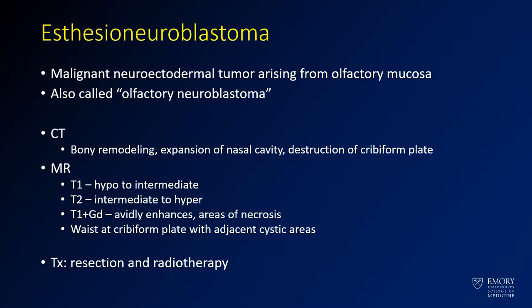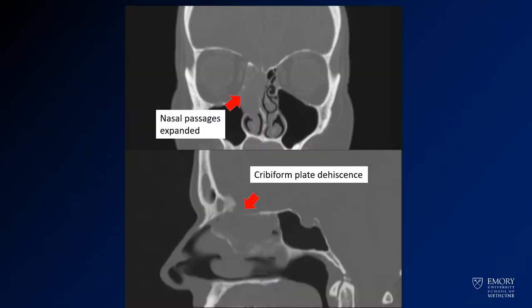The treatment for this mass is resection and radiotherapy. On the CT images, there's expansion of the right side of the nasal passages and loss of definition of the turbinates on that side. You'll also see thinning of the cribriform plate — the normal bony definition of the anterior cribriform plate is lost, where there should be more bone in that region.